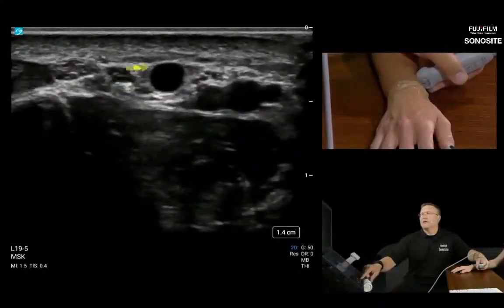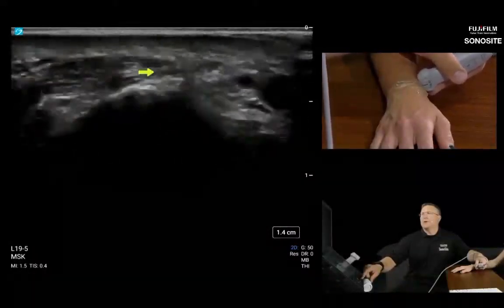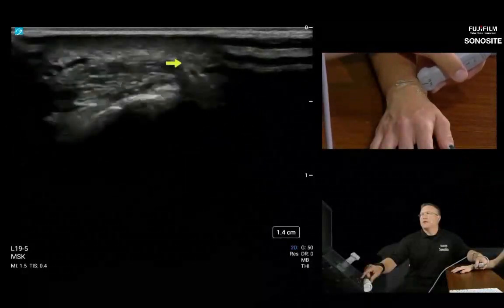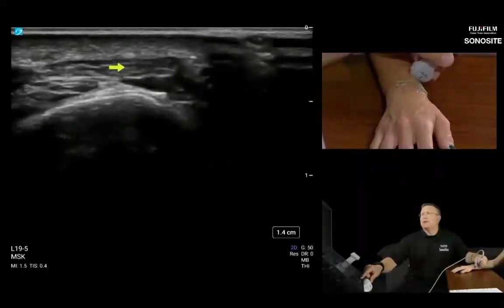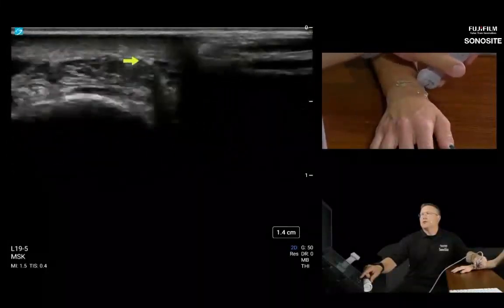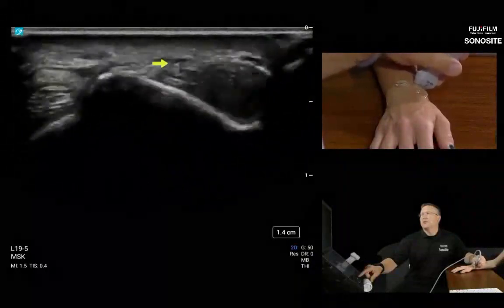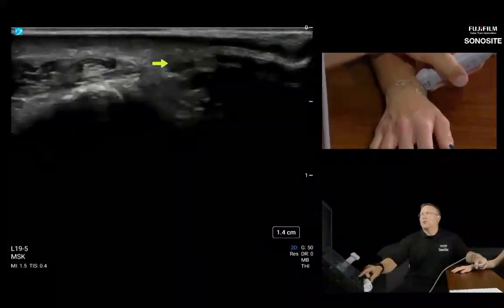We're going to watch them bifurcate, still following this one here, and there's another branch on the other side of the cephalic. As we go distally, almost every centimeter or so, we see these superficial radial nerve branches bifurcate again. So here's another bifurcation. And you can roll it over that first compartment just by tilting the transducer. I'm just going to roll the probe over that compartment, and you'll see this radial nerve almost click over the first compartment right there. All I'm doing is rolling over compartment 1 proximally to distally.